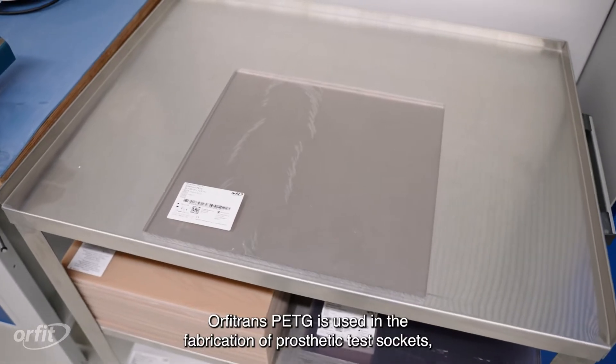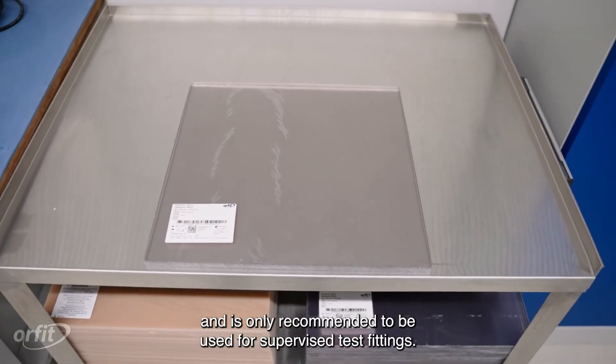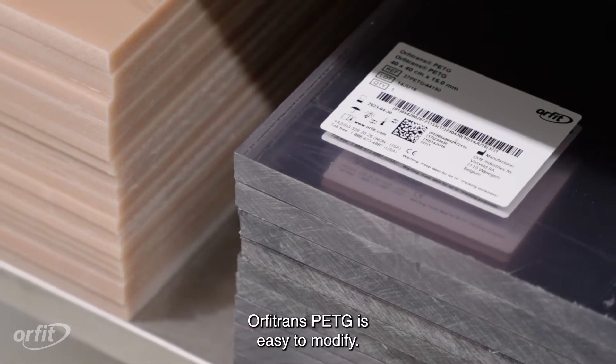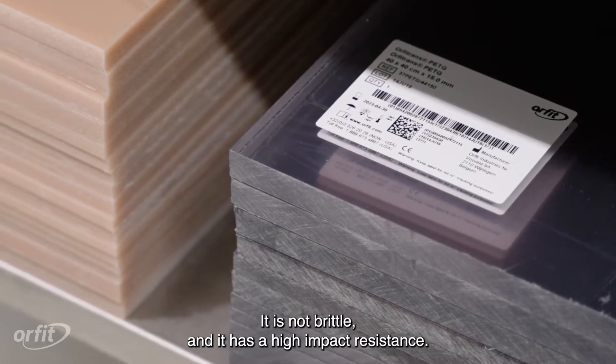Orfitrans PETG is used in the fabrication of prosthetic test sockets and is only recommended to be used for supervised test fittings. Orfitrans PETG is easy to modify, it is not brittle, and it has a high impact resistance.